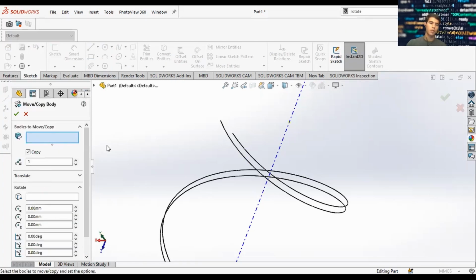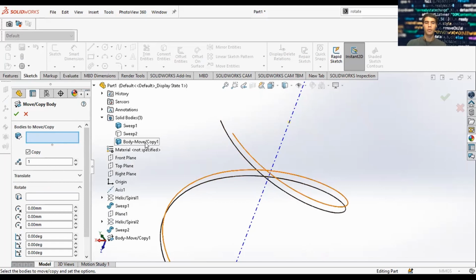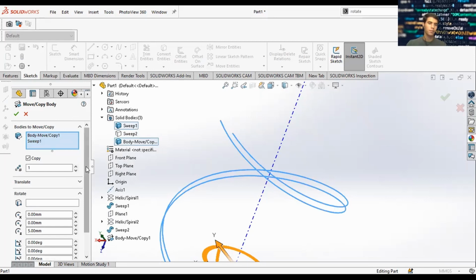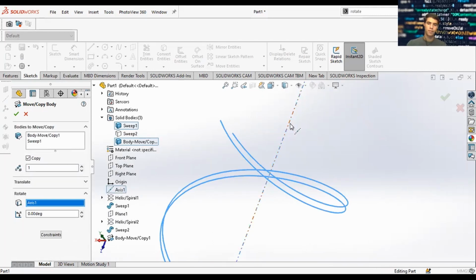Bodies to move. And now we'll select both of these bodies. You can select them on the graphical design window, like here in this window space, or you can go here to the left and select them under solid bodies. So we have sweep 1 and body move / copy 1. Press Control on your keyboard and you select both of them. Rotate around your axis. And this time I'm going to rotate it 30 degrees.